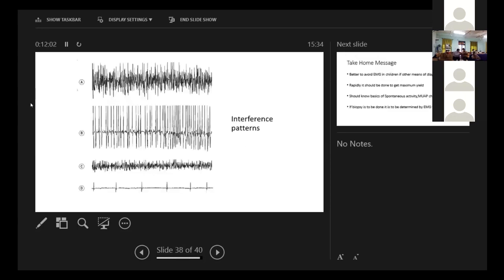These are few common interference patterns where we see that this is the neurogenic pattern. This is a typically myopathic pattern. And this is the pattern when we see that activation is very low.